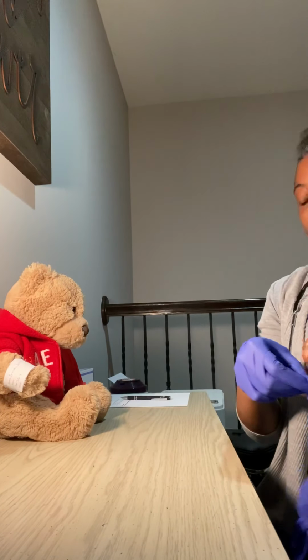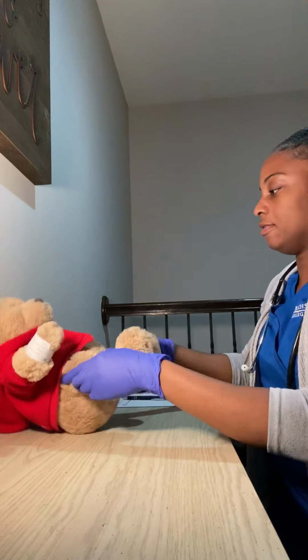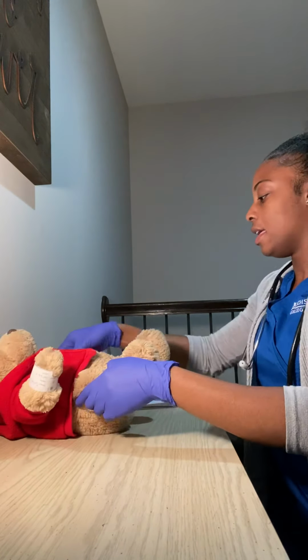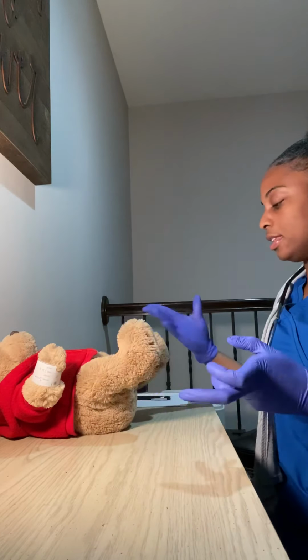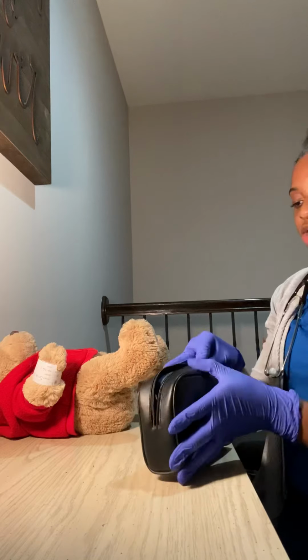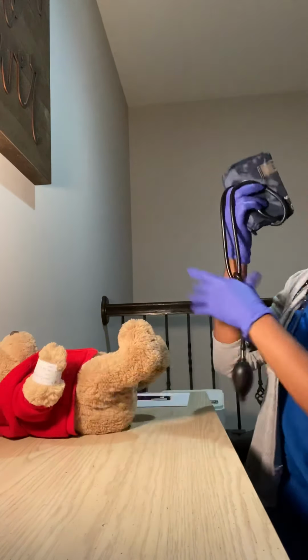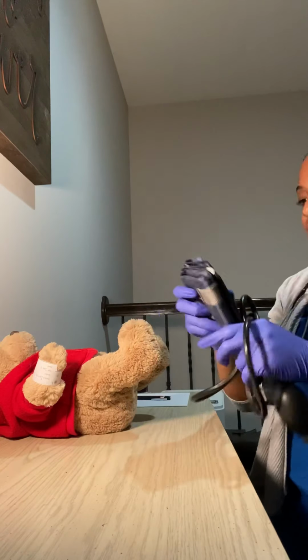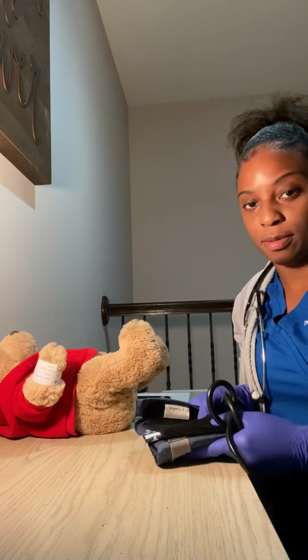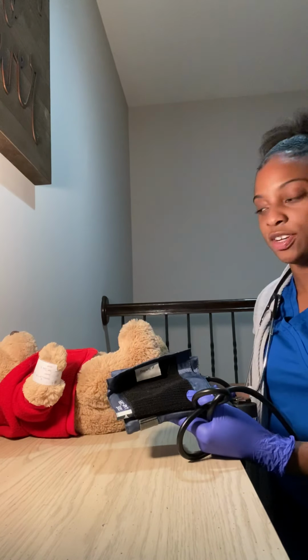So I'm gonna put on my gloves. I'm gonna lay her down flat. And at this point, I will go ahead and I'm gonna start with the blood pressure. I would use my blood pressure cuff. Obviously, it's not gonna fit around my teddy bear, but use my blood pressure cuff, take her blood pressure, of which we got 120/70.